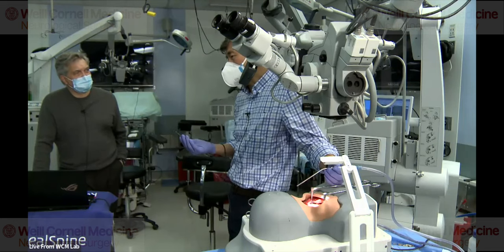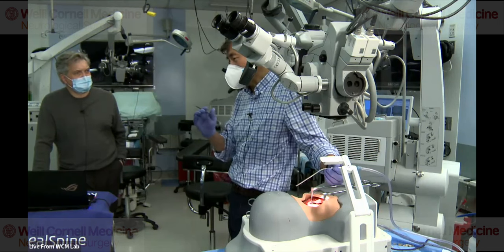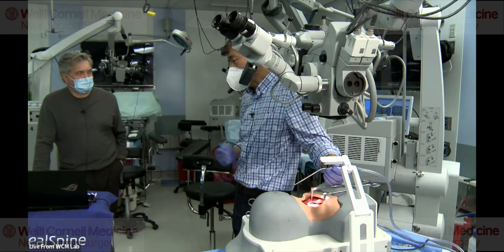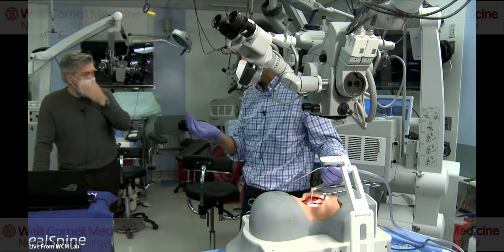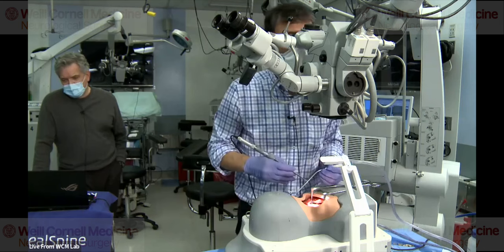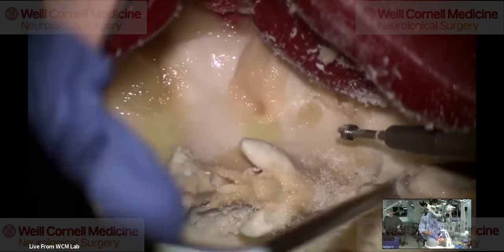Some people like to use the ultrasonic to cut that, and I think that works. The only concern I have with that is that it burns the bone and you may not heal it on the hinge side, but I know guys who use it and think it's really wonderful, and that can help prevent it. But using a tiny matchstick, I think, is the best, and just keeping an eye on it and not going too deep is the way to do that. I think I had my only leak actually with the ultrasonic. Oh, is that right? Yeah. Okay, so it doesn't prevent it then.